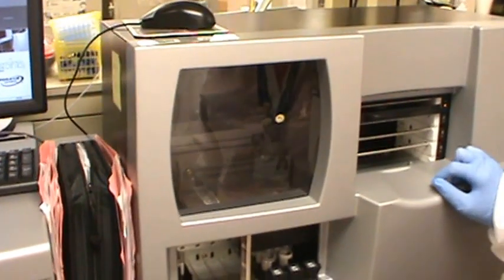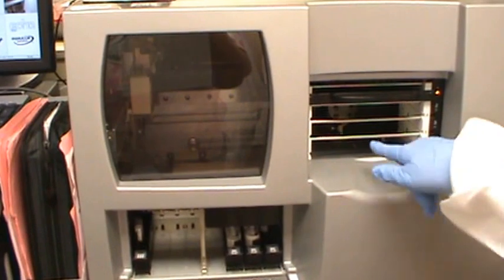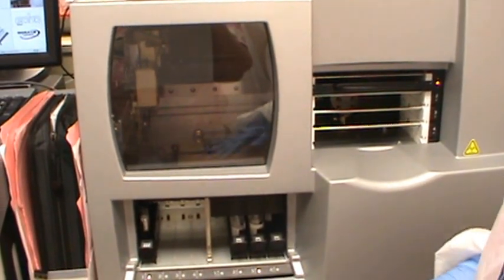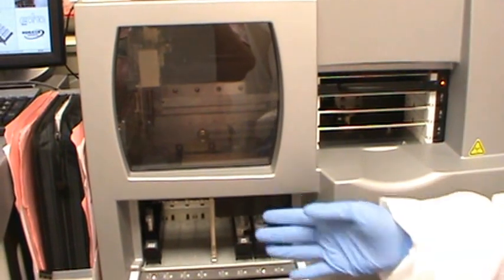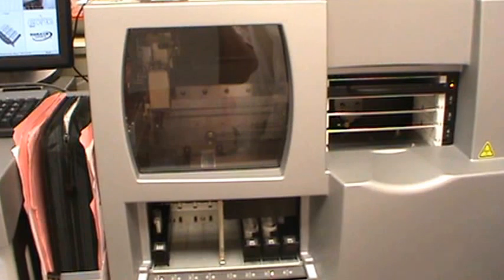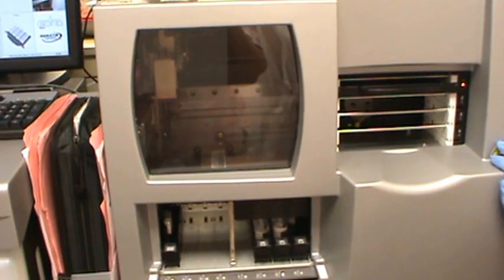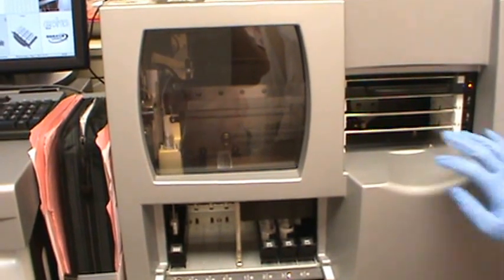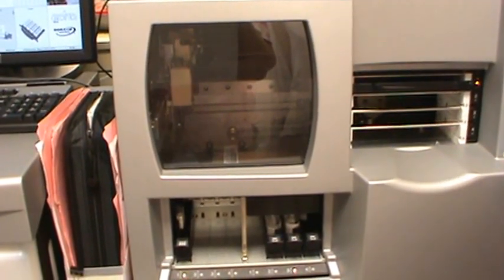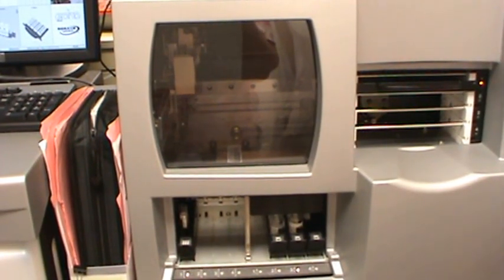Now he is sampling from our patient, and he's going to move it into the camera, and the camera is just going to check for any kind of issue, like if he had gone down and taken cells instead of plasma. It's checking for the color. Now it's going to come over and get your cells. Going to get a little bit of saline in there to make a suspension.